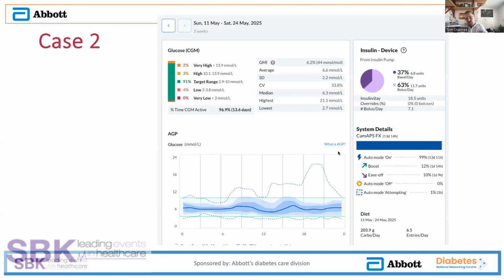And then you've got the same question around the pump target versus the sensor target. And everyone's going to have this temptation to want to set him a high target because that will somehow give him warnings. But this is a man whose average glucose is 6 and who panics when his glucose hits 7. And if we're setting him an alarm at 4, he doesn't really perceive blood sugars between 3 and 4 as being an issue. So his alarm would go off, but he'd just ignore it because he's like, it's only 4. So if it was going off higher, he'd ignore it even more. And so what we want for him is for the alarms to be useful.